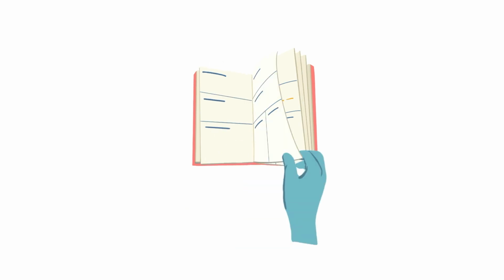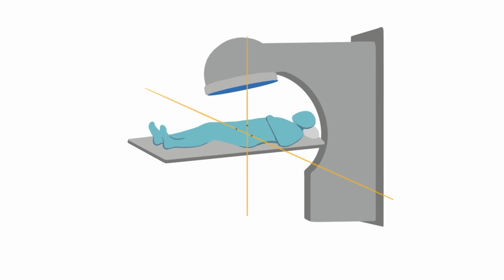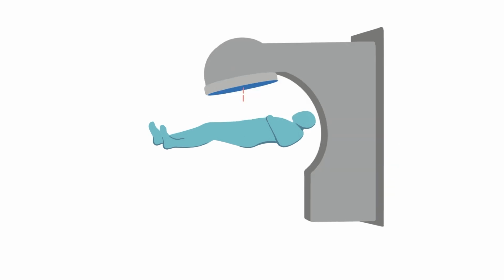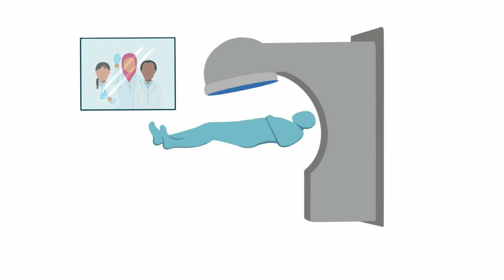Having the treatment itself is quite painless. You just lie down, and the radiographers check that you are positioned exactly as they want you to lie, so that the X-ray beam is applied precisely to the area being treated. And this is the hardest bit in the few minutes while the treatment lasts, lying exactly still in that position. But you don't feel anything while that's happening. The radiographers can't be with you in the room when the machine is on, but they can see and hear you, and you can talk to them if you need to.